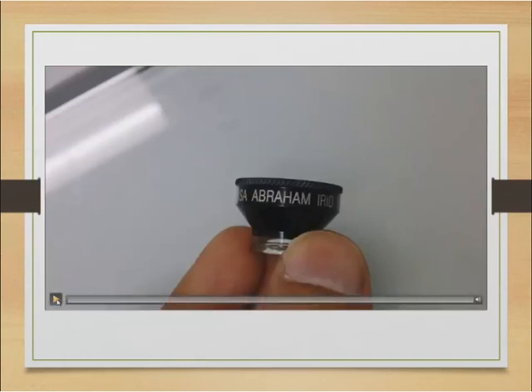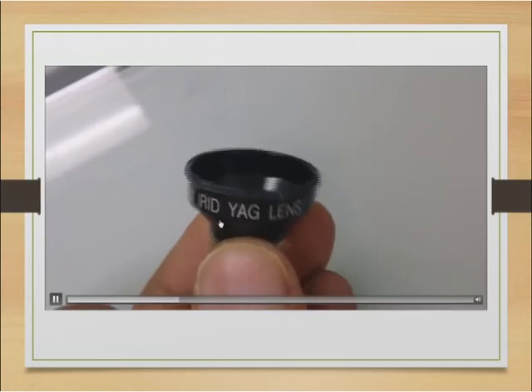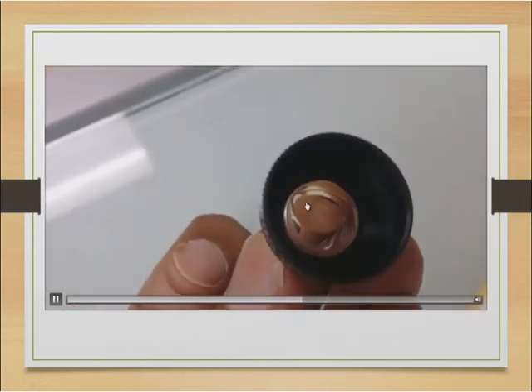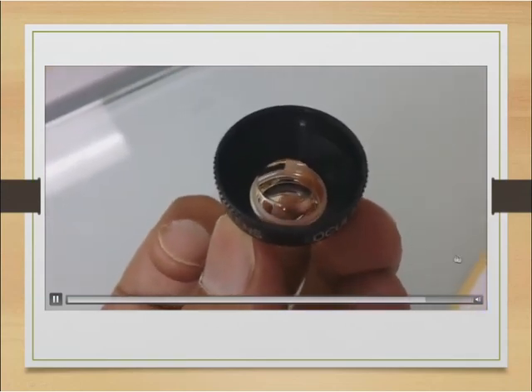Here's a video of what the YAG laser lens looks like. It says 'irid YAG' on it, and again there's a slightly larger magnification central point. That's where you want to put the center of your crypt.